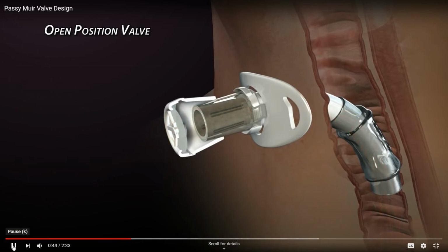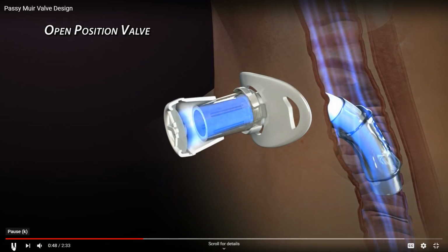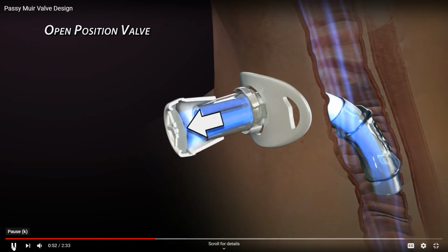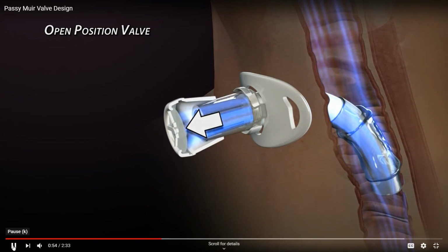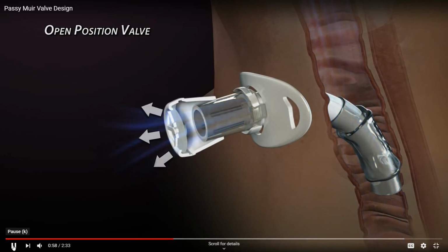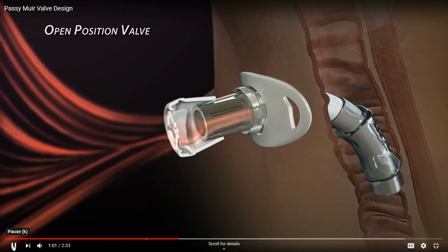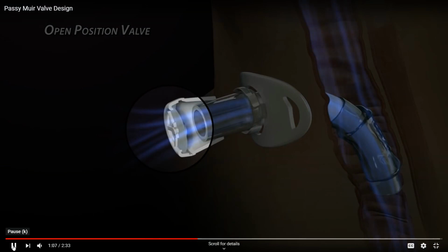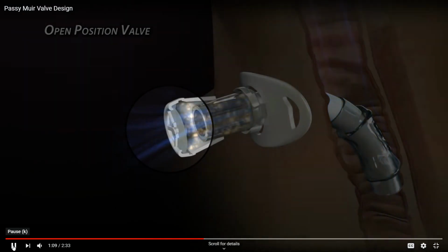At this point, the valve is not actually closed. Reversed airflow, which is produced by exhaling, is necessary to force the membrane against the valve body to produce a seal. Before the membrane actually closes, there is a short time lapse where some exhaled air can escape. In addition, some common breathing patterns create an airflow phenomenon that can cause the membrane to vibrate or oscillate, which prevents it from completely sealing, resulting in noise as air leaks out.